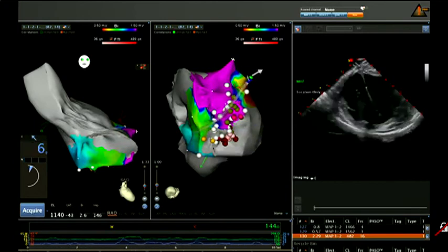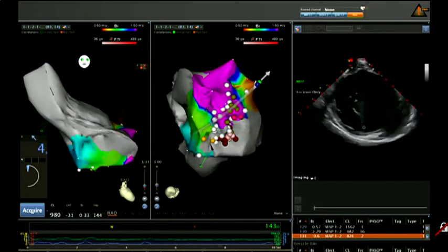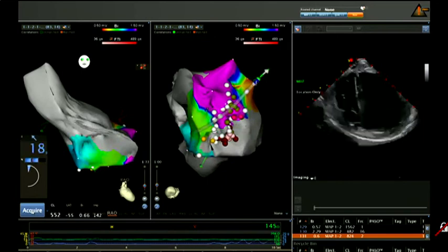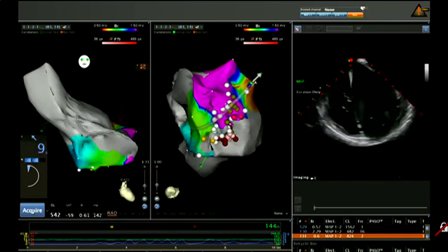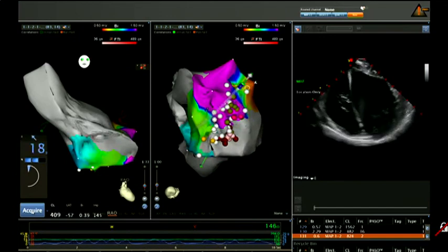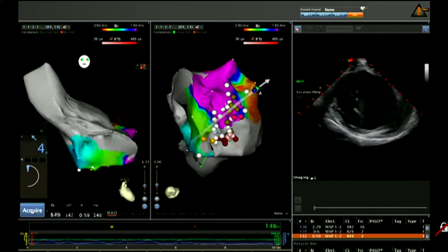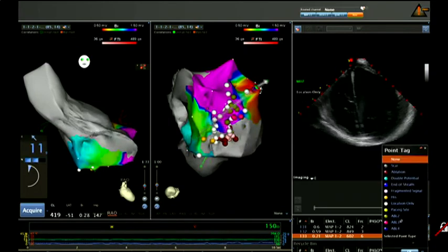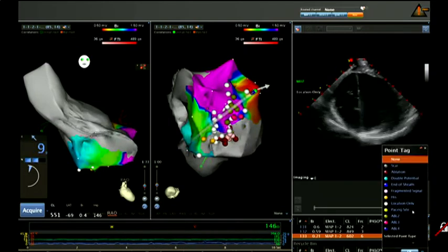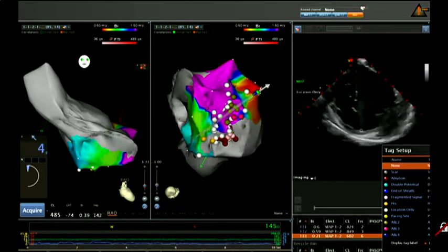This is one of the biggest limitations of isoproterenol. Not just that you induce sinus tachycardia and hypotension without a PVC manifestation. Most of the times when we are using isoproterenol, maybe the PVCs come, but after we stop the isoproterenol. But in this case it was very interesting that after 4 minutes, as I said, the patient started to present bigeminism.